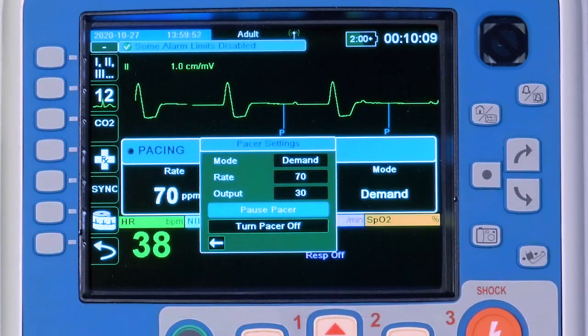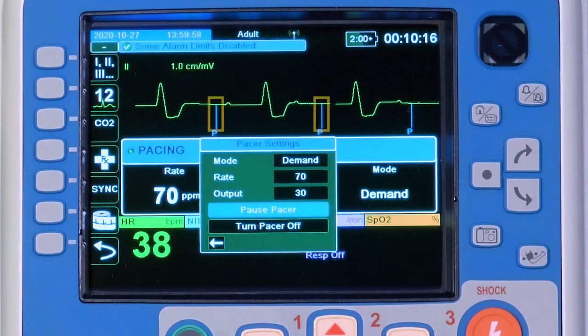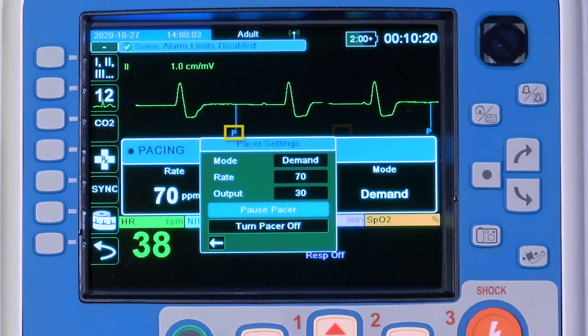When the X-Series Advanced Pacer is active, a blue bar will appear at the top of the pacer window, and blue pacer markers will appear in the ECG. The letter P will appear under each pacer spike.